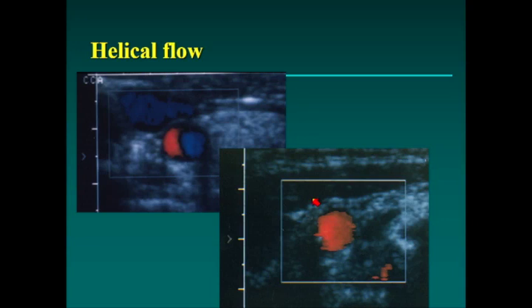And if you angle your transducer radically up or back, you'll get a solid color because there's two vectors of movement here. There's the vector that, of course, is down longitudinally, the length of the vessel, but there's also the part that's spinning. So there's part of it that's coming at you and part of it that's going away from you in a true transverse.